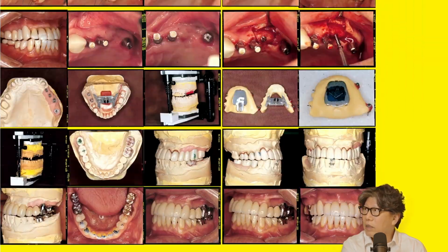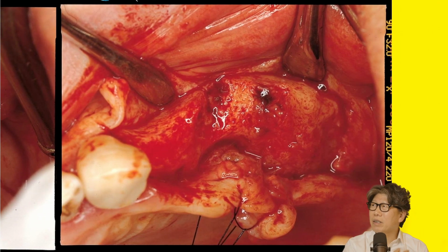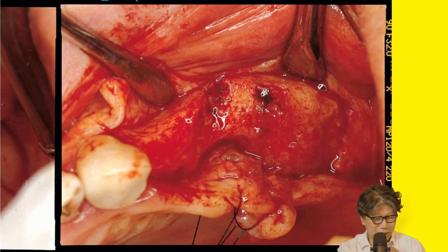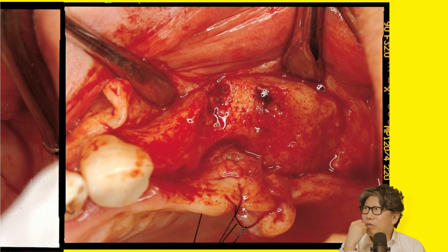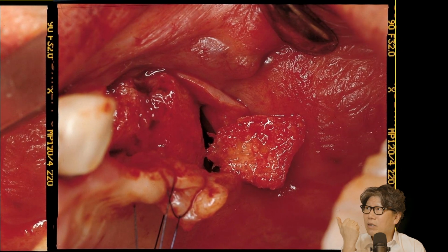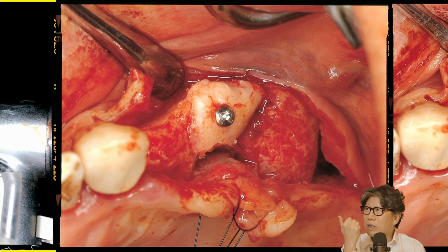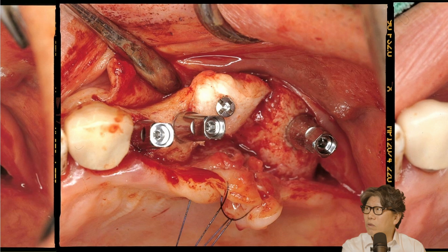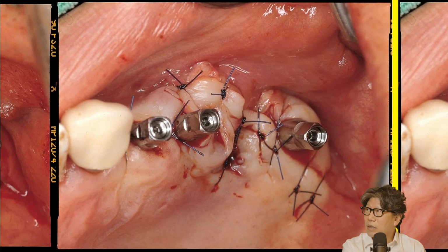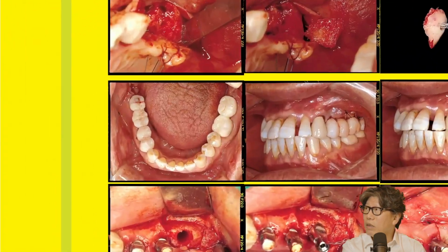It's troubling, actually. So now incision, I think I was trying to be good at something back then. So I'm doing incision design, and nowadays I'm doing it a little bit simpler, tuberosity side. I had a chisel at the time, and I would use it to take the bone off, and it would fall out. So now I drill a hole, and then I put bone like this, and then I put an implant next to it, and then I suture it, and then I do a block bone graft like this, and then I do immediate loading.